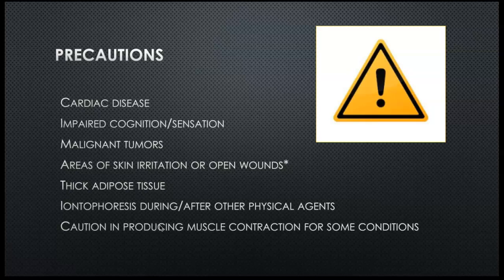If you're doing iontophoresis and delivering a drug, you've got to be cautious about whether or not you decide to combine that with another physical agent, such as a hot pack or a cold pack. For instance, you put ionto on somebody because they have tendonitis, but you also think they need an ice pack at the same time. But then the ice pack makes them numb and they can't feel anything, and they're getting a skin burn from the ionto, right? So you've got to be careful about how you choose to do that.